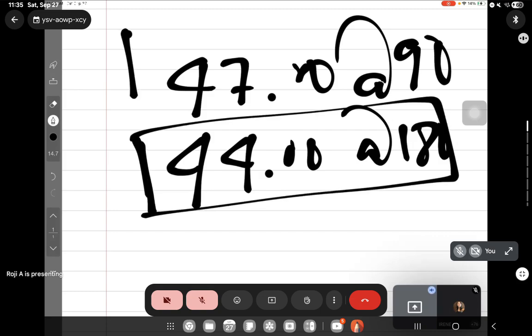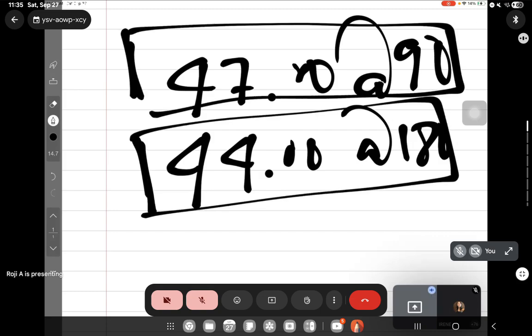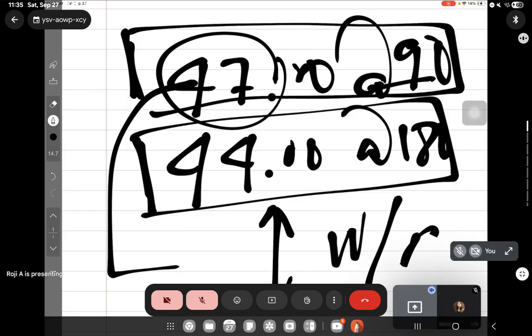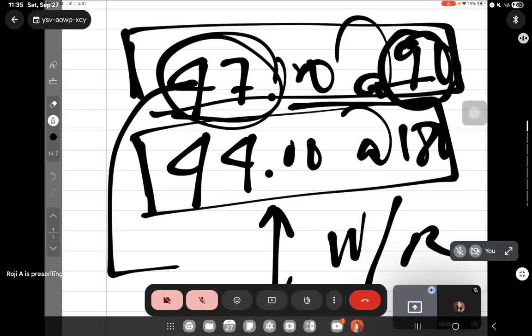Therefore, my patient, based on this alone, is at 90, highest or steepest. Therefore, if 90 is steepest, this is a with the rule. Correct? Yes po. Based on looking at this alone, you would know right away whether it's with the rule or against the rule.